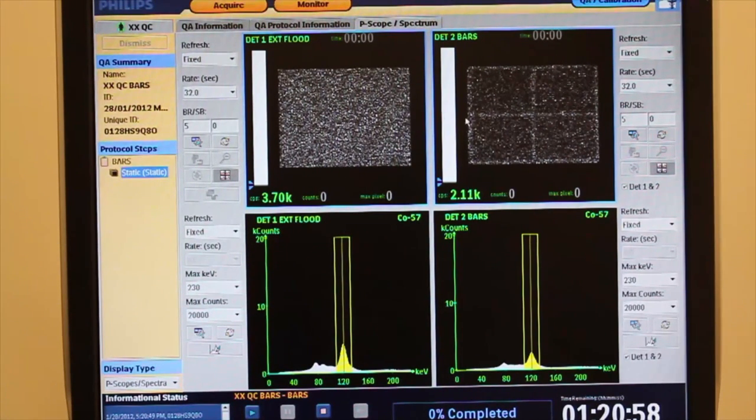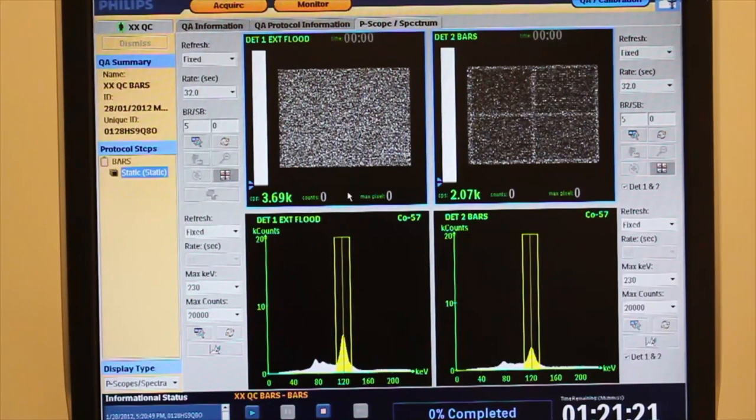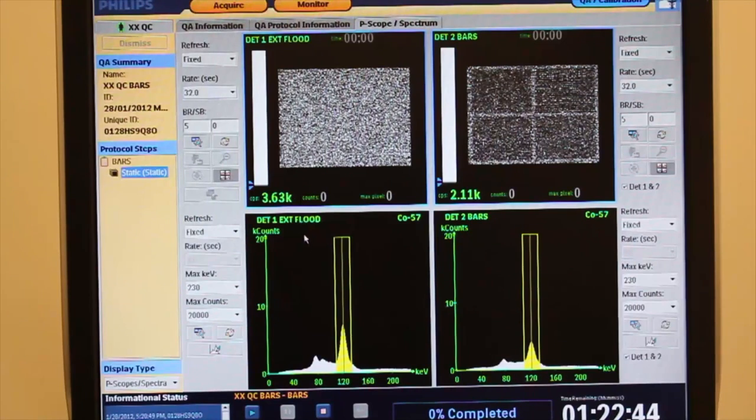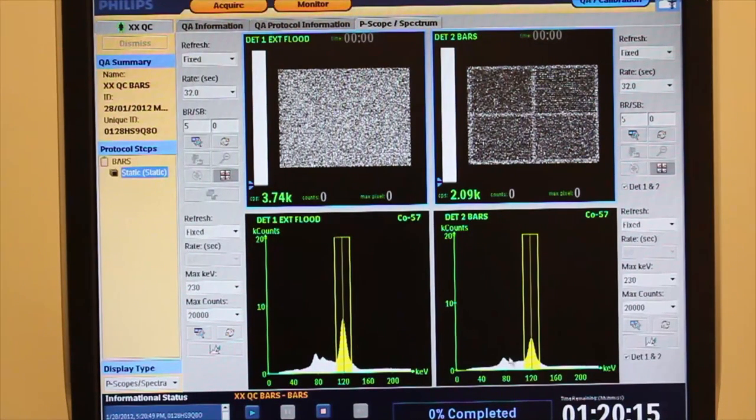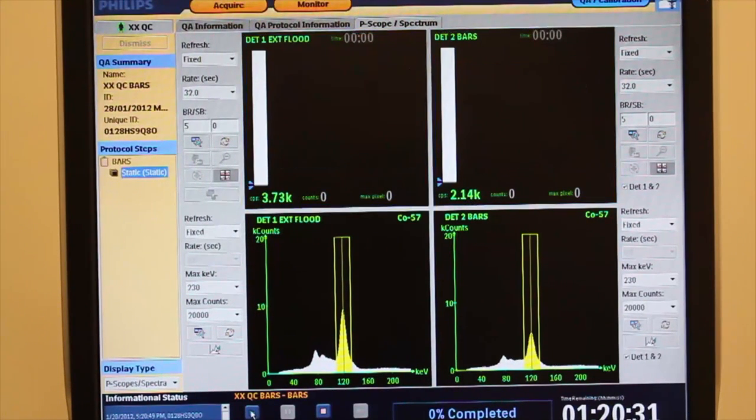If we chose to do an extrinsic flood on detector one, we would peak it. Detector two having the bars acquisition would have been peaked previously. Note the decreased count rate on the detector with the bar phantom on due to the attenuation of the lead bars.